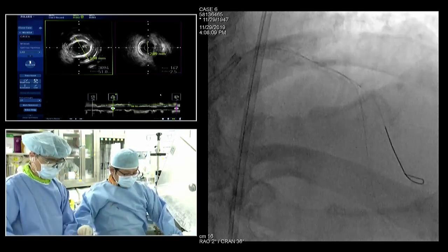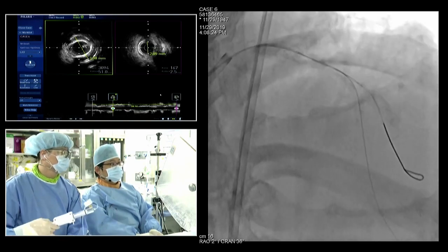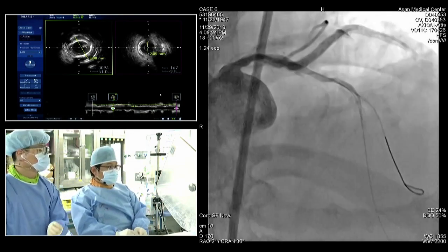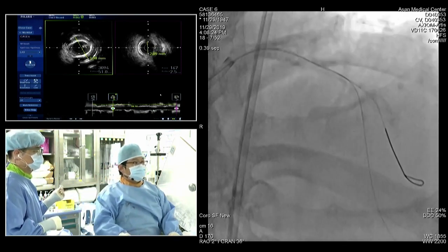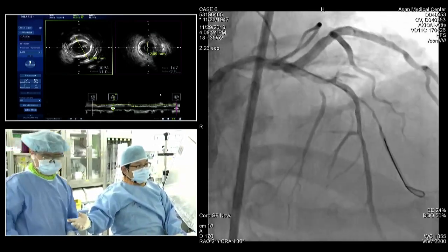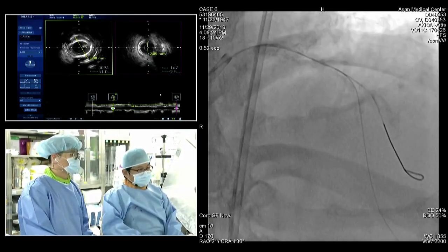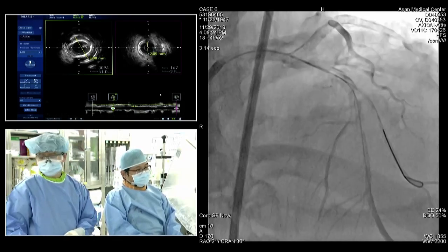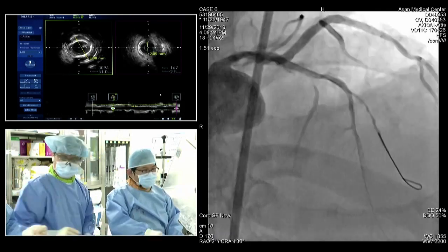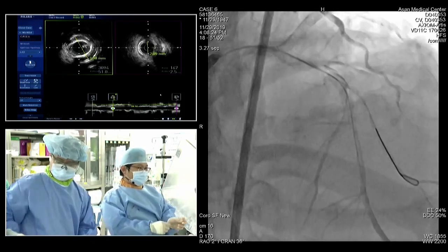So ready? Good. Please give me the two. Compromise. Definitely, I need one more wire. Nobody knows the fate of the diagonal branch. I thought the big second diagonal may be suffering. Yeah, right. Do you ever put wires in septals?